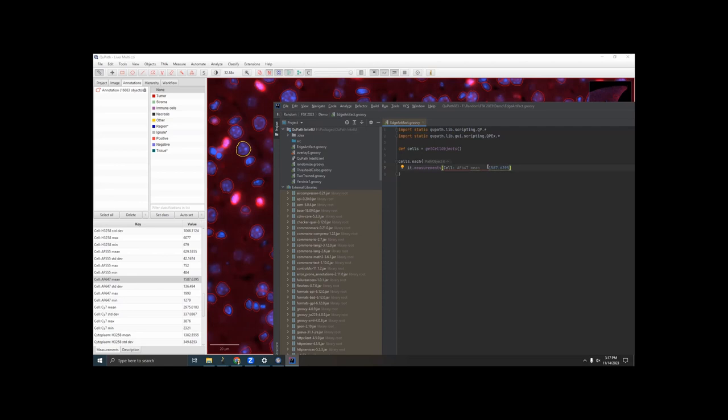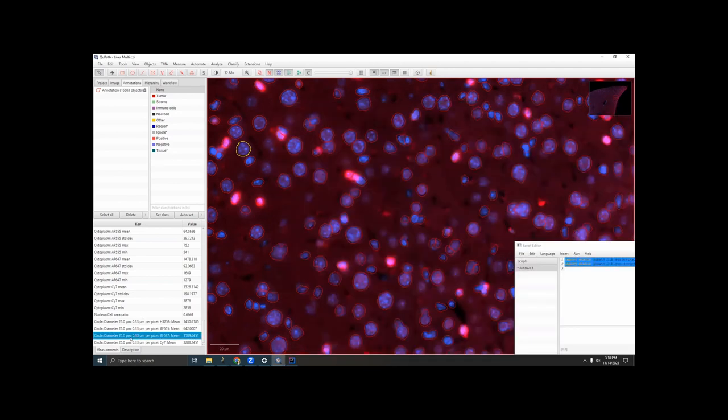And when you paste it, it includes the actual measurement value for the cell, and I don't want that, so I'm just going to delete that and put this inside quotation marks to make it a string. So overall, this calls the value of the 647 mean intensity in every cell. And from that, I'm going to subtract the background intensity. And again, this is it.measurements. Scroll all the way down. And for this one, I really highly recommend you copy paste instead of trying to write it out, because this micron symbol here, it's very finicky. You can't just write U, it needs to be that exact symbol and that exact font. So it's easier to just copy it than to remember how to type micron.